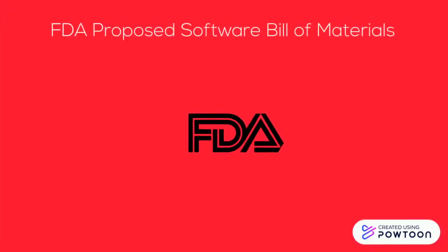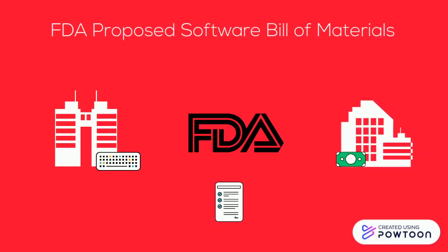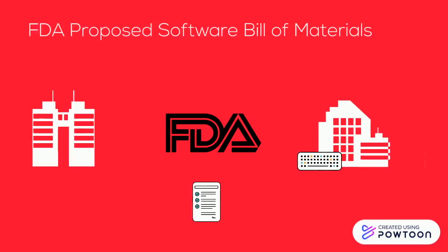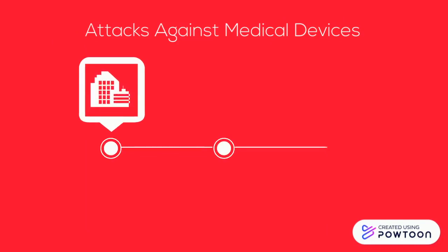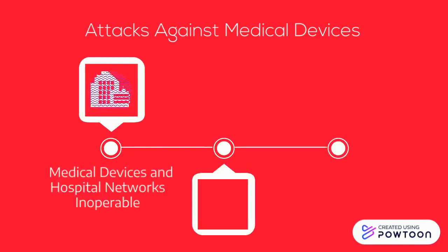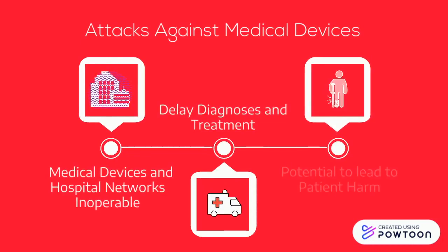The FDA is exploring requiring the medical device industry to submit a software bill of materials as part of its review process before a device is allowed for sale. This is to ensure medical devices are resilient to cybersecurity threats. Cybersecurity attacks have rendered medical devices and hospital networks inoperable and disrupted the delivery of patient care. This has the potential to delay diagnoses and treatment and lead to patient harm.